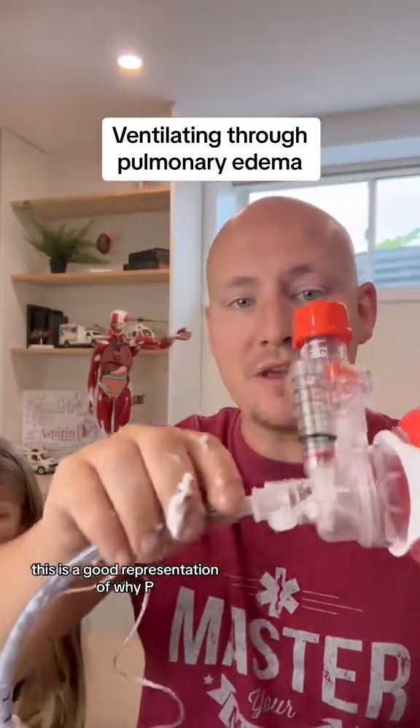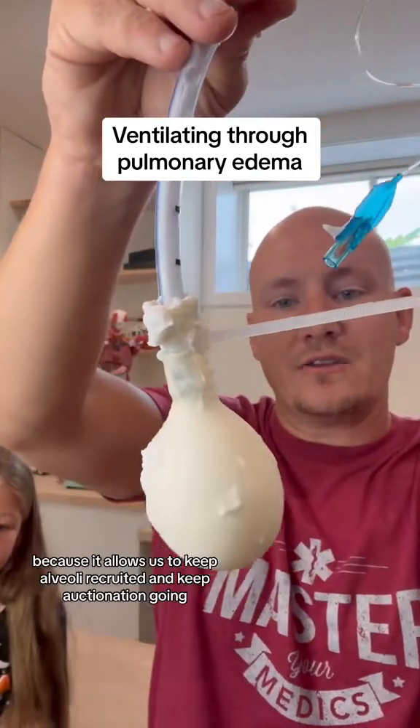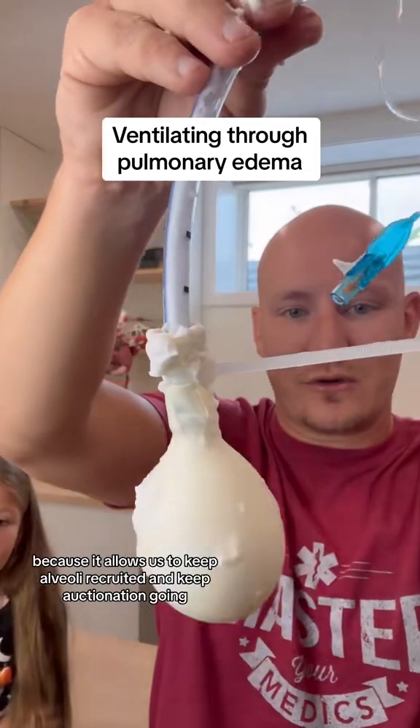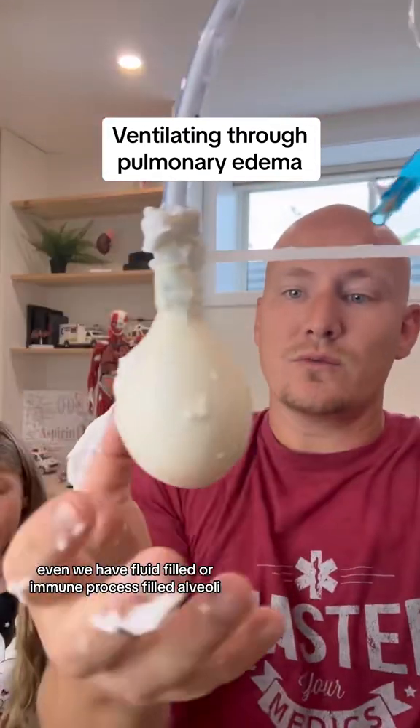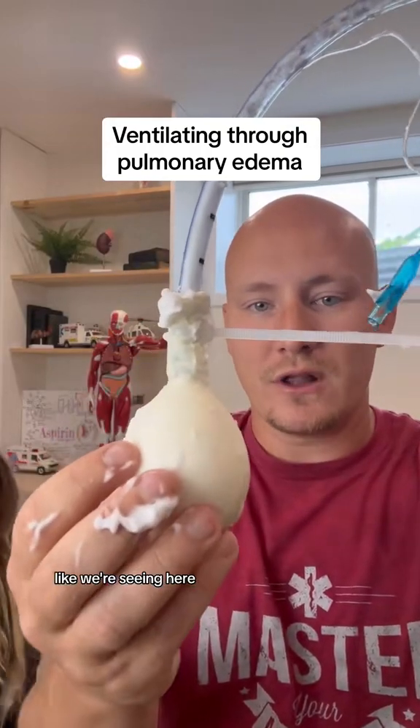This is a good representation of why PEEP valves can be so important in this type of pathology — it allows us to keep alveoli recruited and keep oxygenation going, even when we have fluid-filled or immune process-filled alveoli like we're seeing here.